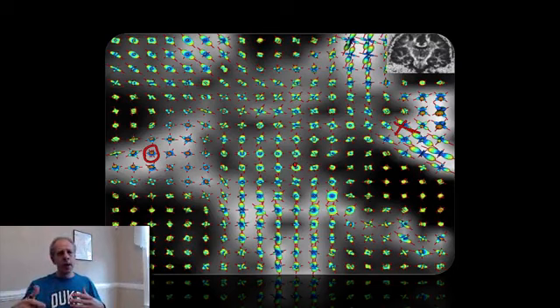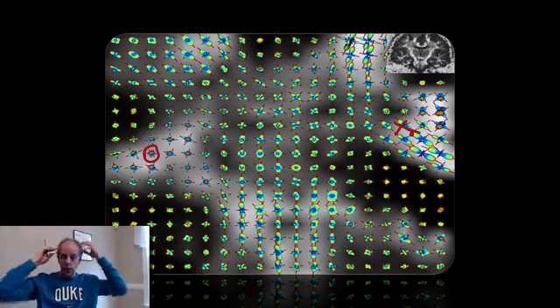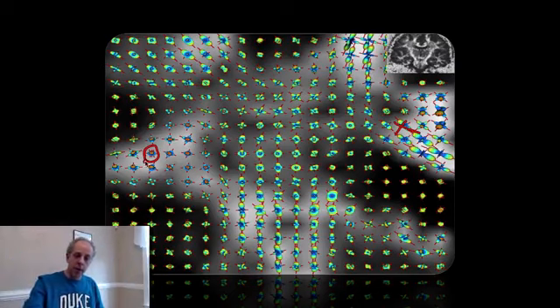There is some image processing to actually get this, denoising and other things, but basically most of the work is done by this very smart acquisition. So you're here and you say, I want to know the probability of connection between now far away regions. Is this region of my brain connected to this region? How can I measure this from this data that I have just obtained?